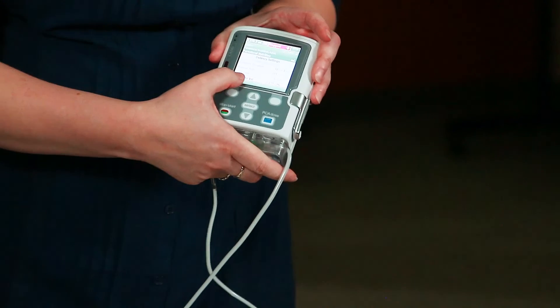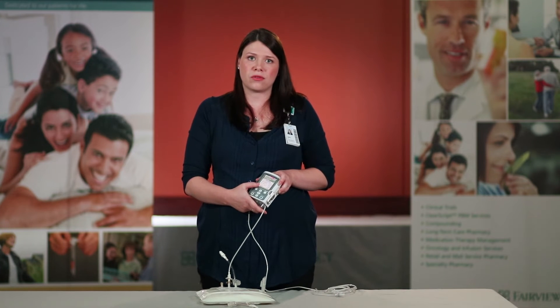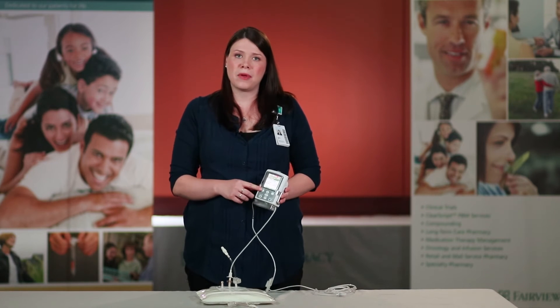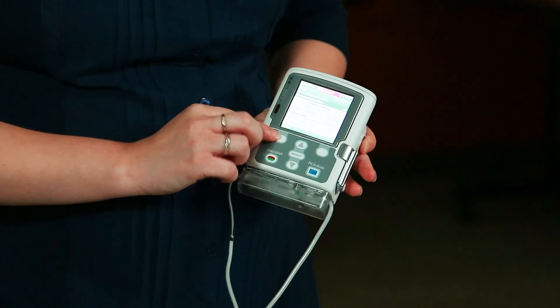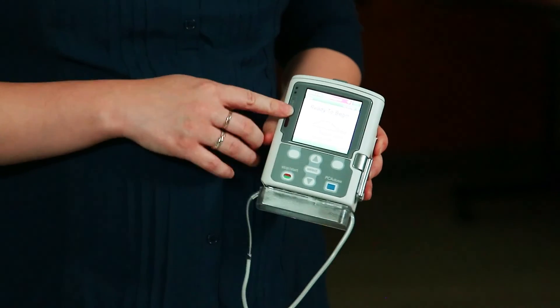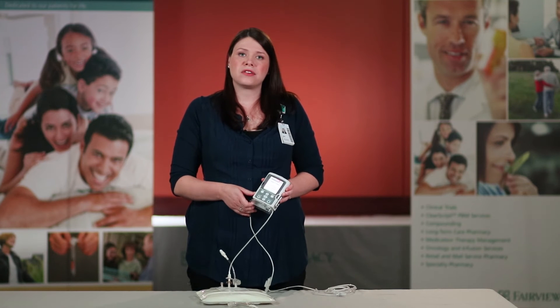You also want to note your reservoir volume. If your reservoir volume does not match your bag, we will discuss how to manually reset your reservoir volume in chapter eight. If everything looks correct on your pump and your label, press the back button until you reach the home screen. Remember, this is very important to do prior to starting your pump to ensure that you are getting the correct amount of medication.